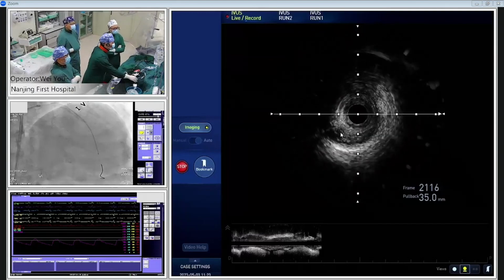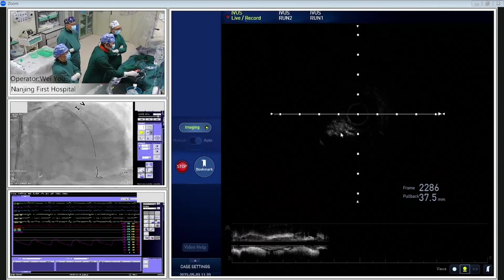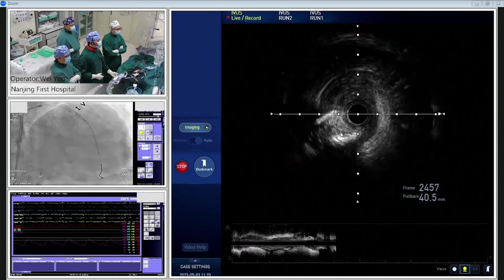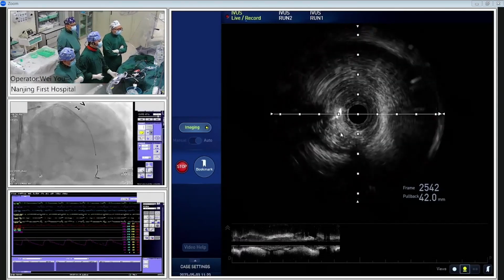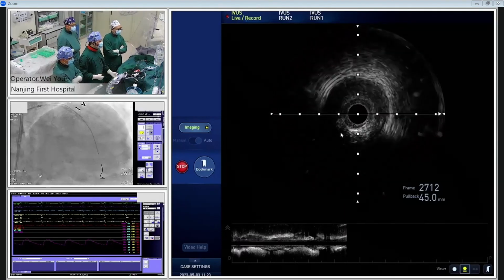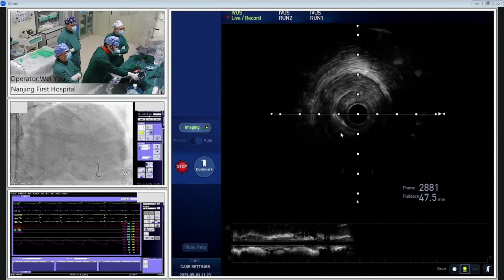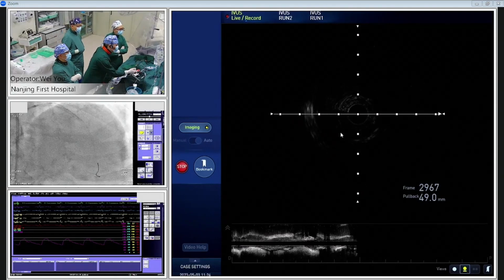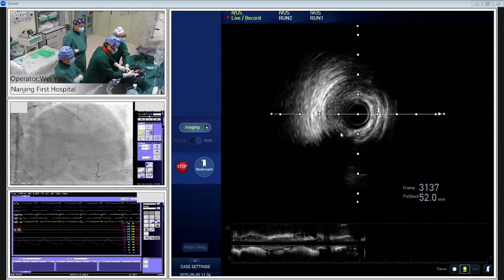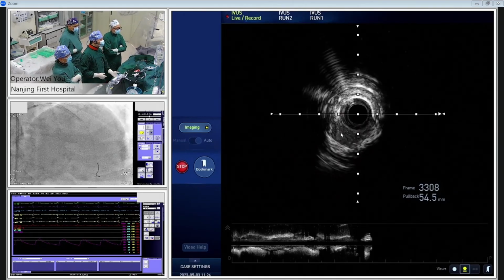This segment is a balloon-dilatable lesion. Maybe NC balloon preparation is enough. Is there any dissection at this site? Maybe just between the septal and the second diagonal. This gives some flush bubbles. Okay, we can also see the reverberation. Yeah, 3 layers.